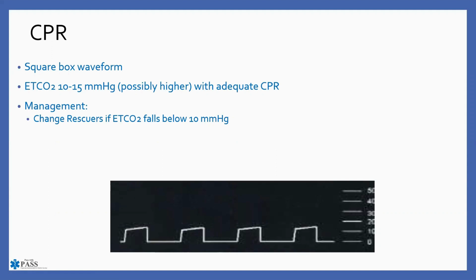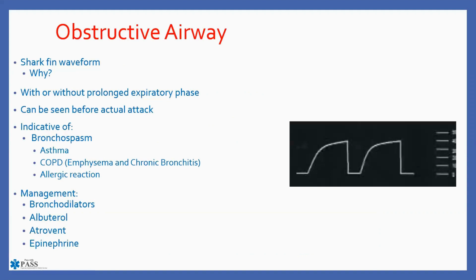a person doing compressions. If you put them on one of the devices to do CPR, the devices don't get tired. So you're probably going to end up finding end-tidal readings a little bit higher, maybe up to 20, somewhere in that area would probably be more realistic. End-tidal CO2, 10 to 15, possibly higher. The management here, you're going to change rescuers if the end-tidal CO2 falls below 10. We know that they are getting tired and you need to change them out.